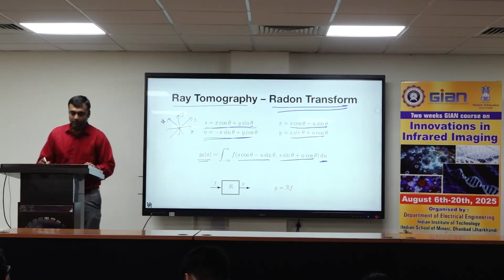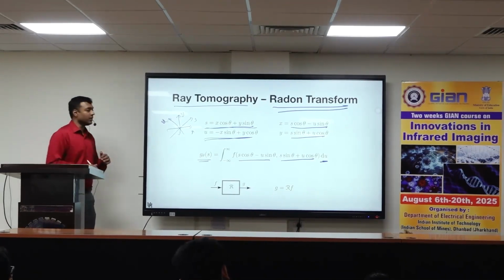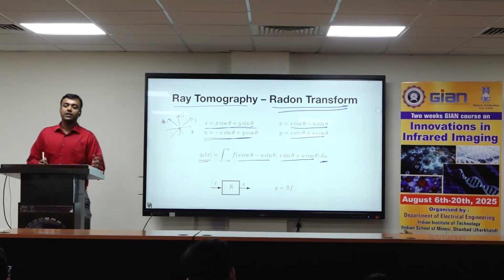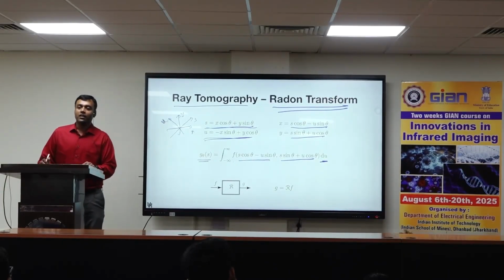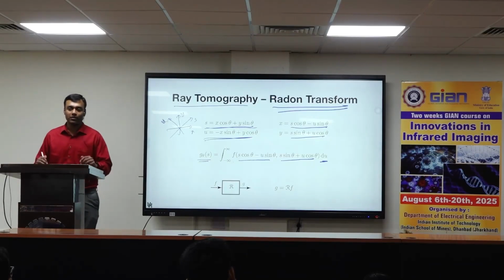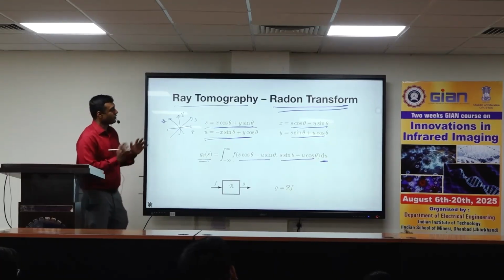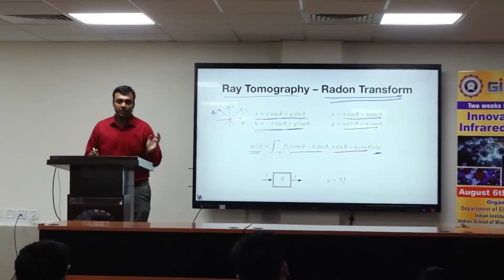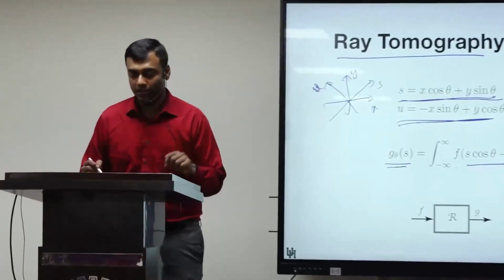Several years later, people figured out that a mathematician by the name Radon had actually figured this out in the 1910s, and had published it in a math book, but nobody knew about it at that time. It was only rediscovered later. So it was in some sense discovered twice by two different people, once by an engineer who was trying to make the instrument, and once by a mathematician before that.